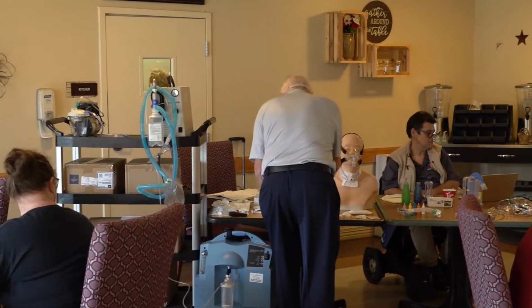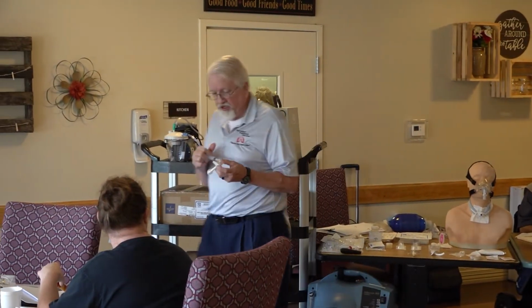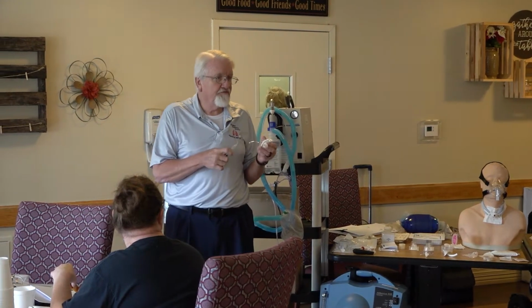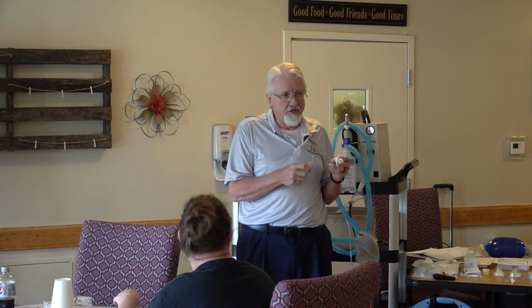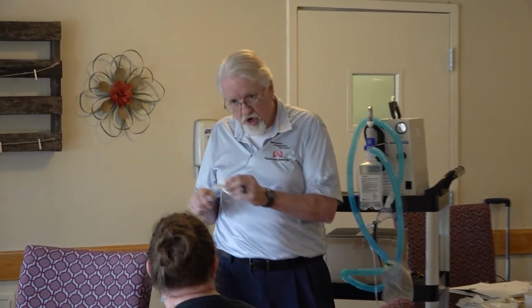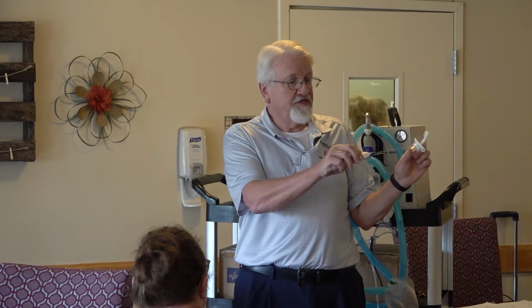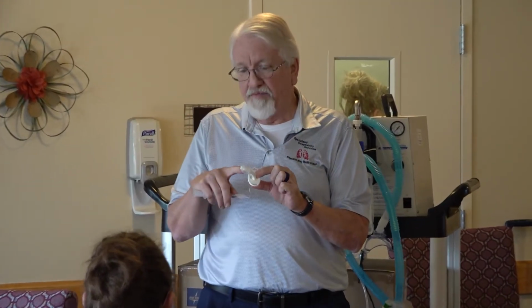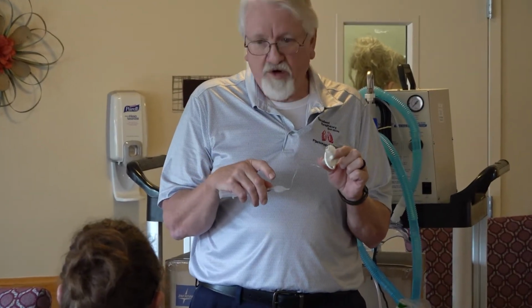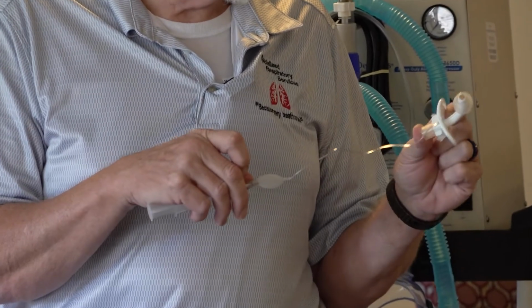So usually there's two things we tell you don't want to see in a SNF, but eventually you guys will be ventilator units, so that doesn't really hold true in the long term. Usually, you would not want to see a patient come in with a trach that has a cuff on it, because typically you have no reason for a cuff trach unless you're going to put them on a ventilator. That's the only reason you'll have a cuff trach.